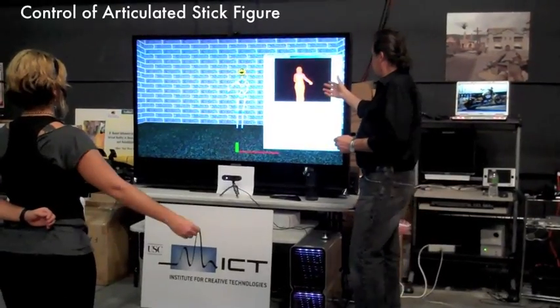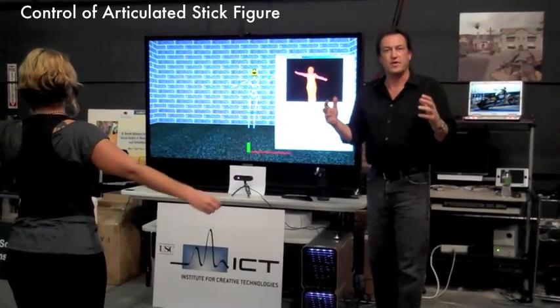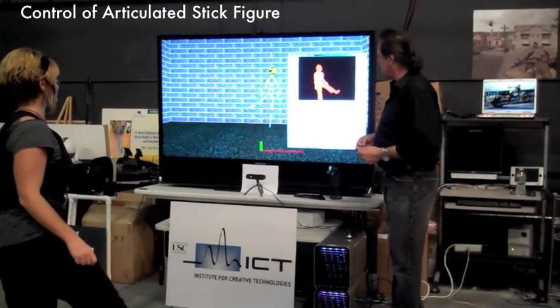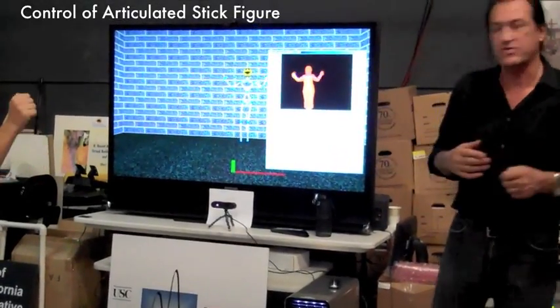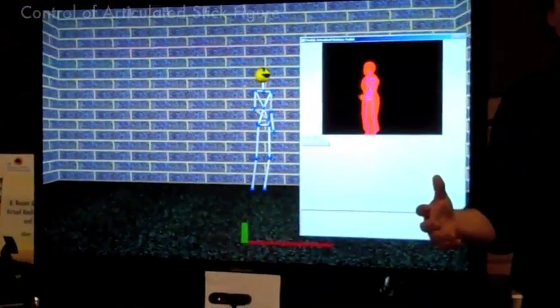The articulated stick figure here actually renders the movement of the user, and you'll note that we can put that into a digital puppet so the character can move, and it's a natural movement in 3D space as the user interacts. This provides us with great opportunities for designing rehabilitation applications.